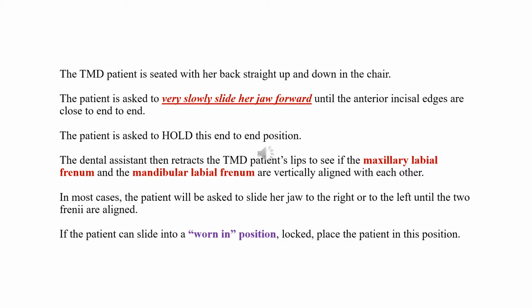So the TMD patient is seated with her back straight up and down, and sometimes I'll do this standing. And technically, it's probably best to do it standing with the head in the correct position, although the bite position is the same whether you're standing or moving your head around. That's a difficult concept, and we'll get to that a little bit later, but the therapeutic bite position is one position, how the upper and lower jaw is positioned against each other. And that's the one we determine.